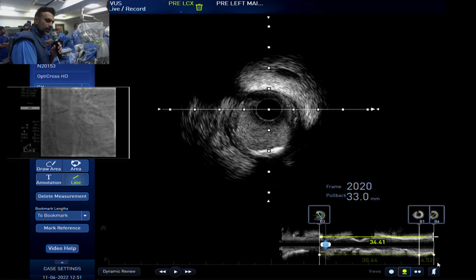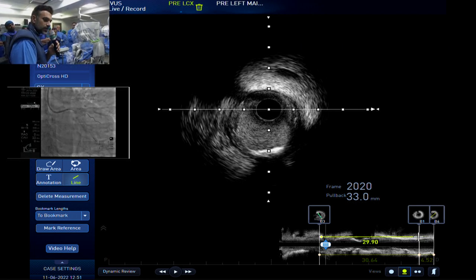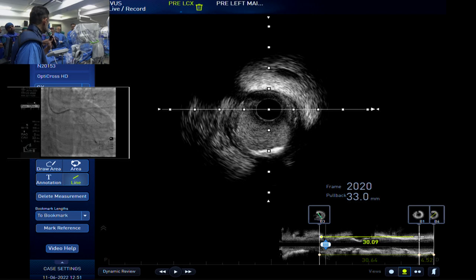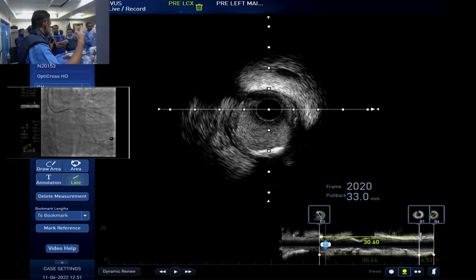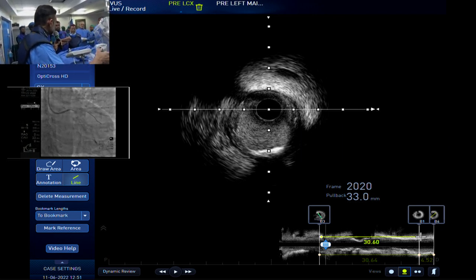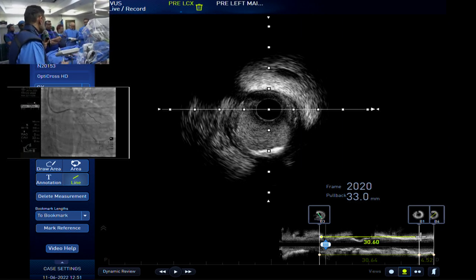So if we wanted safety, okay, a 38 is going to be a bit long, right? So I would be very comfortable with a 32, or, you know, 38, whatever. I would probably go with like a 2.5-32 here, Synergy, put that in, and post-dilate it distally with a 2.5-15. Proximally, I take a 3.0-15 and you're done. You just repeat IVUS at the end.